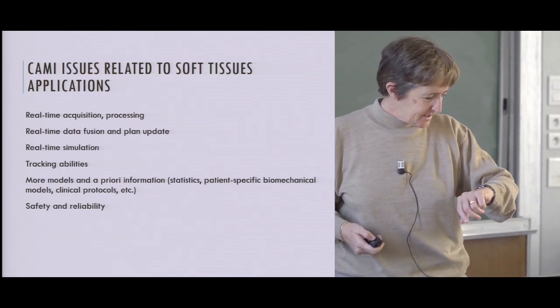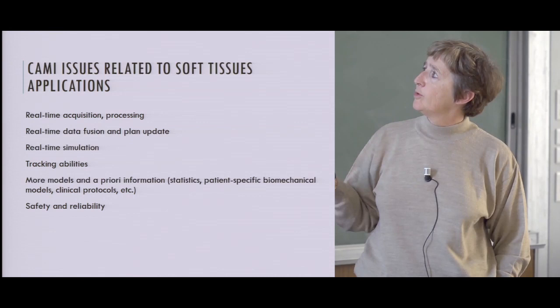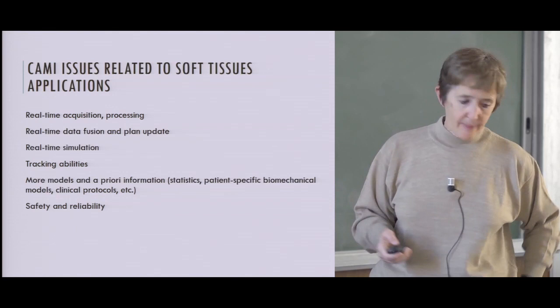Okay, so let's come back to the issues related to soft tissues. As I said, you have to make a real-time acquisition of data, processing, data fusion, also simulation in some cases to predict motion and deformation, and you need to be able to track. Of course, there are safety and reliability issues, which are also big.